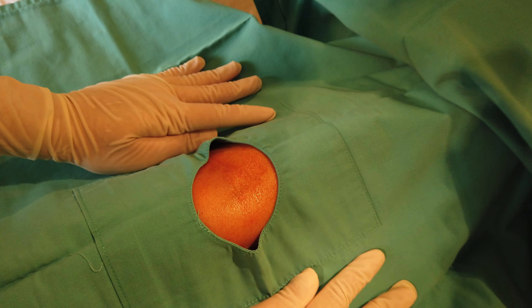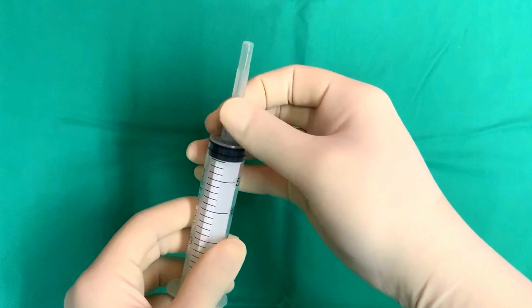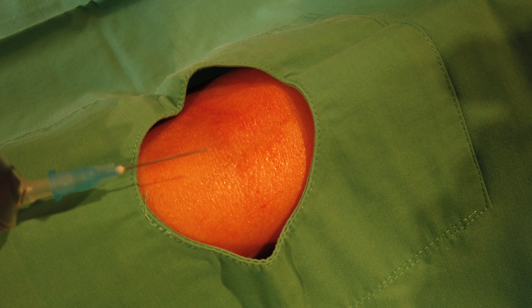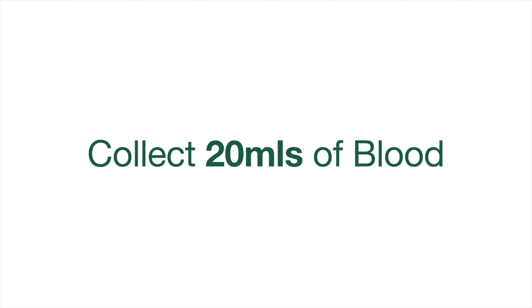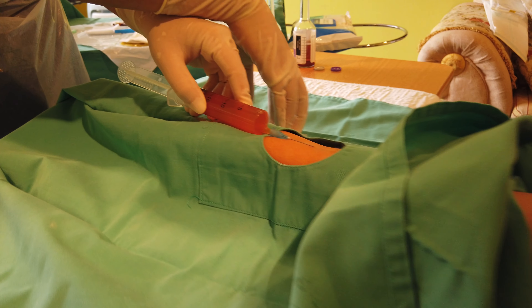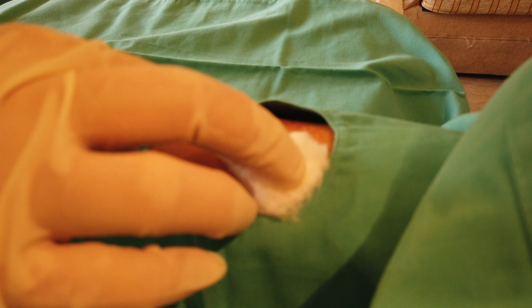You may now place your whole towel. Assemble your needle to your syringe and puncture the vein. You should sample a minimum of 20ml blood for 2 bottles, which would be at least 10ml for each bottle. Once blood culture is obtained, instruct your assistant to remove the tourniquet. Use a dry cotton swab to compress onto the puncture site and remove your needle.